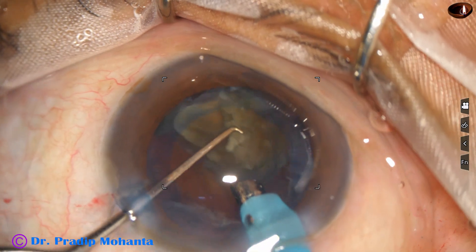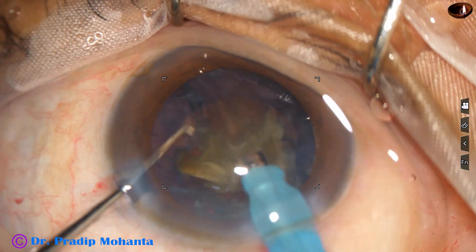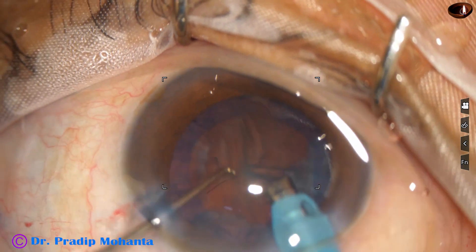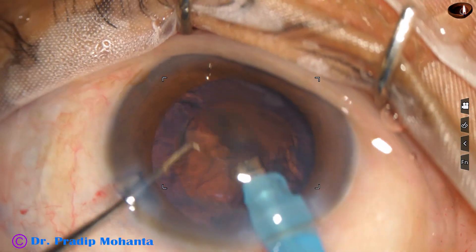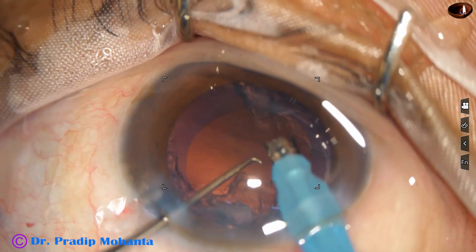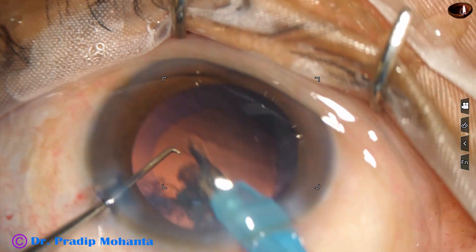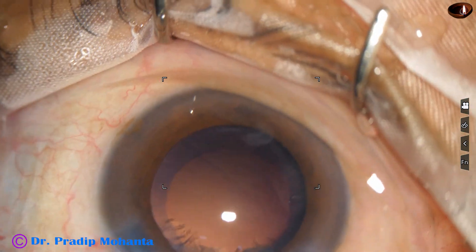This is the last piece. At this time the assistant reduces the vacuum to 350 and flow rate to 35. The epinucleus is removed at 350 vacuum. I could also remove some cortex with the same setting — 350 vacuum and 35 flow rate.